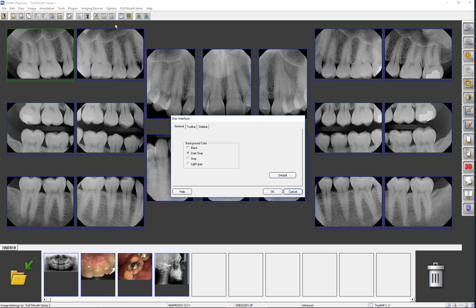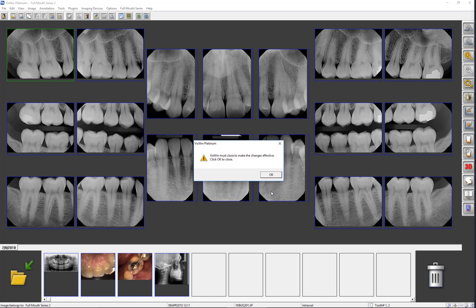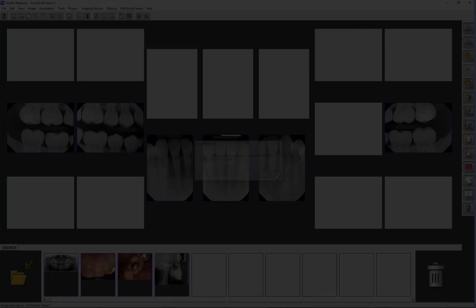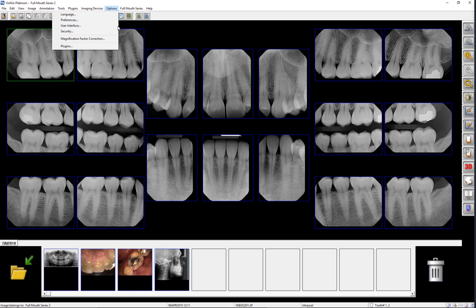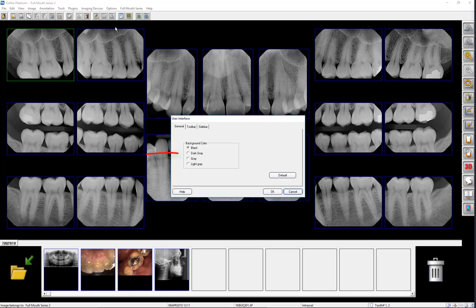A dialog window will appear allowing the user to change the background color. Let's select the black option, then click OK. You will need to close and reopen VixWin for the change to occur. Click on Dark Gray, the default color, or on Default to return to the dark gray desktop.